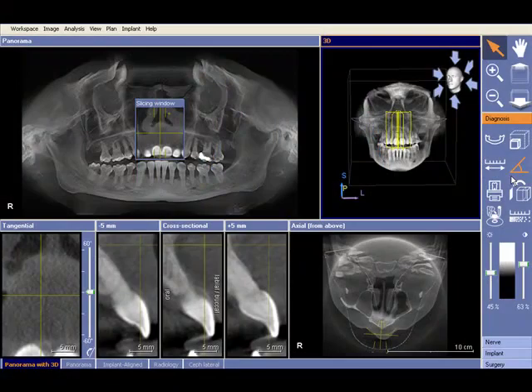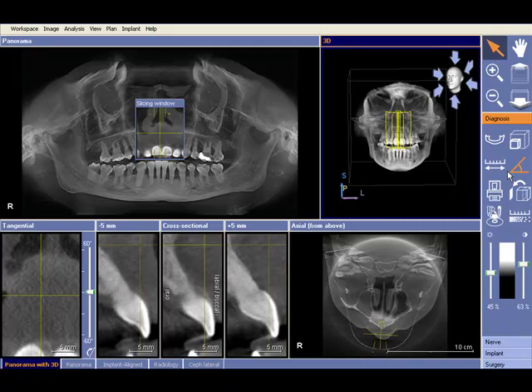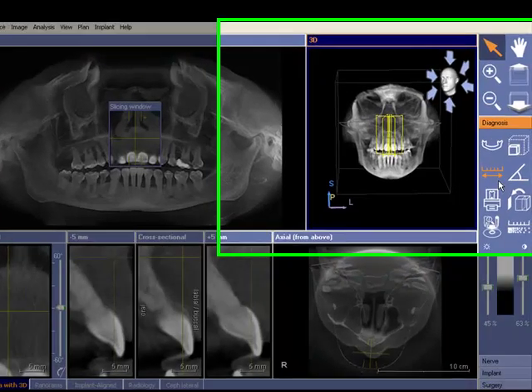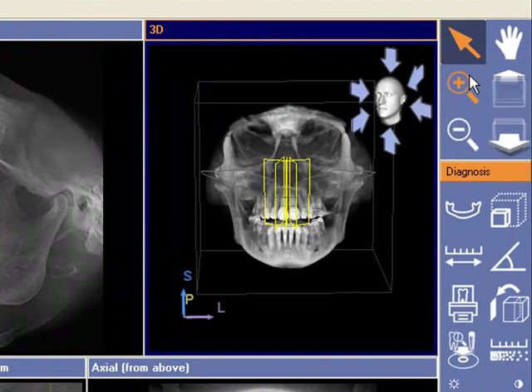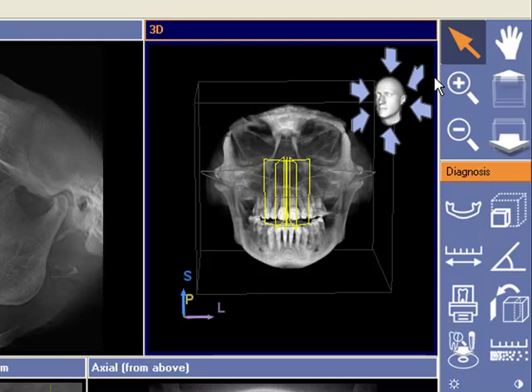This demonstration is to show you how to use the zoom function. The zoom function is here up on the top right hand side. You'll also be able to use the scroll key in the middle of your mouse if you have one — between the left and right mouse click should be a scroll bar.